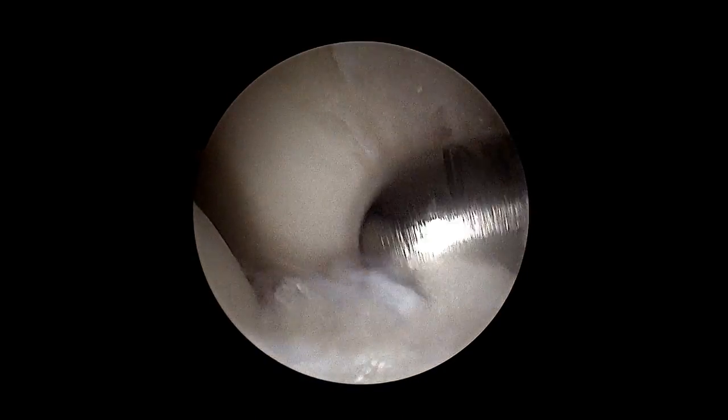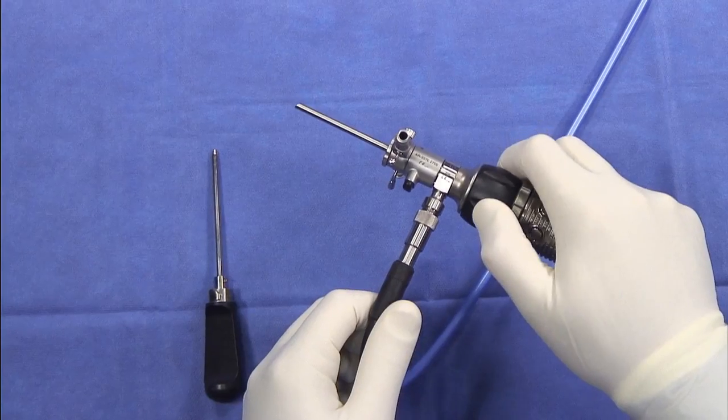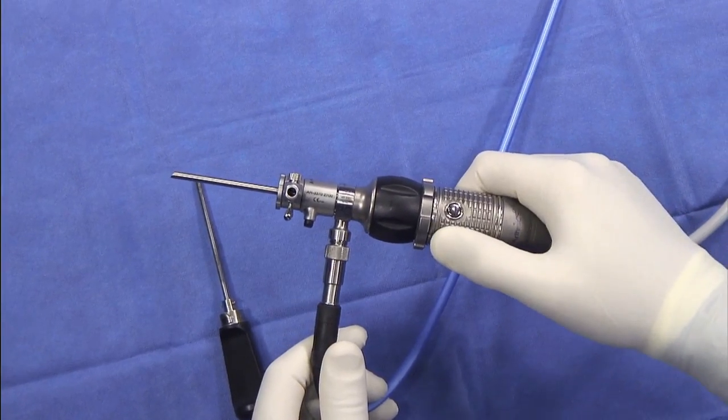The depth of field is such that I no longer have to continue to focus the camera as I move through the joint. The perfectly placed buttons allow me to zoom as well as control brightness, along with capturing pictures and video.